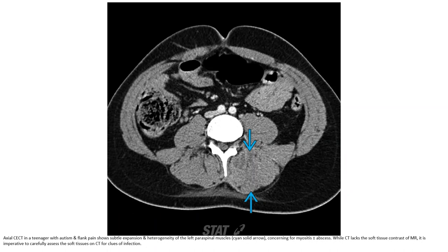This is a contrast-enhanced CT in a teenager with flank pain, showing stranding, expansion, and heterogeneous enhancement of the left psoas muscle, concerning for a psoas abscess. While CT lacks the soft tissue contrast of MRI, it is imperative to carefully assess the soft tissues on CT for signs of infection.